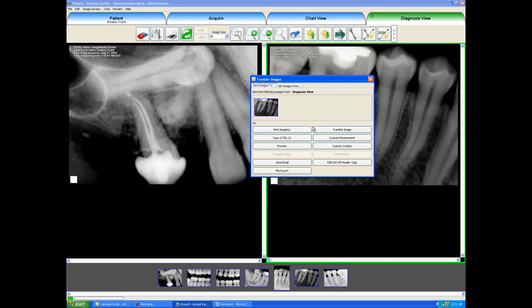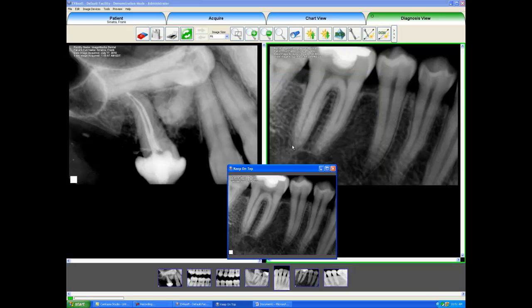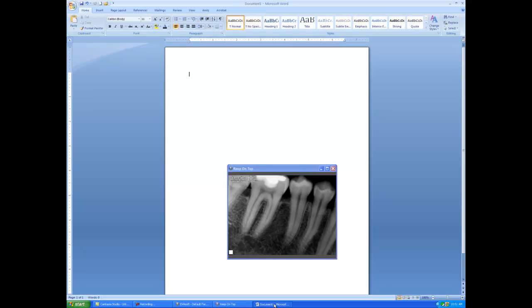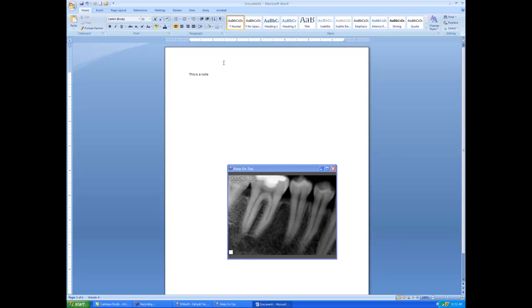One of the nicest functions we have in the right-click is the Preview. When I select Preview, it says Keep on Top and I will select that, and now this image will keep on top of all other windows. So I could go into a Microsoft Word document as an example and the image stays on top and I could start typing. We can also do this over any practice management software chart function, so I could be in the chart module and take clinical notes in my chart while I'm looking at the x-ray.